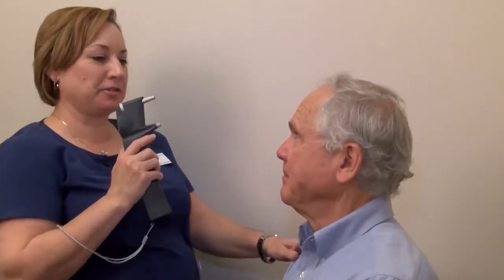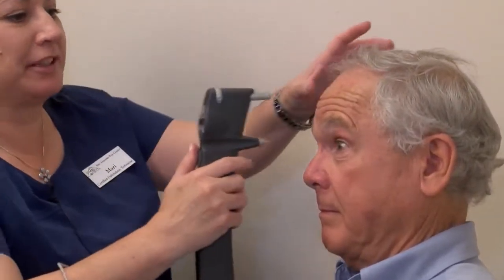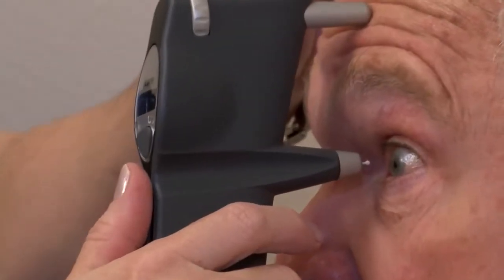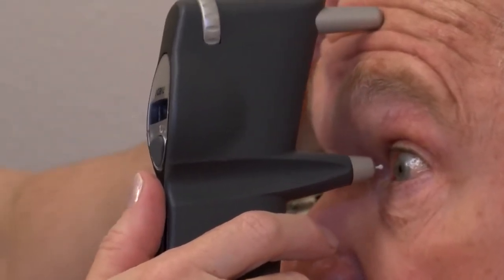This is an iCare tonometer. We're going to take Dr. Harris's pressure. Dr. Harris will look exactly parallel across the room. We're going to get this little head rest right there on his forehead. He's going to look straight ahead — it's parallel. We're going to press the button.